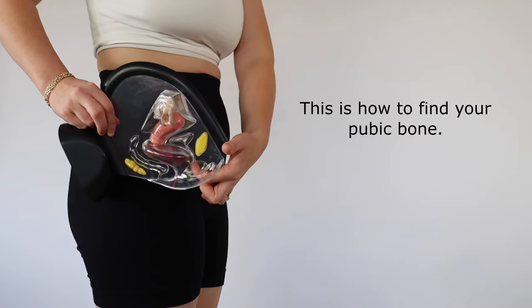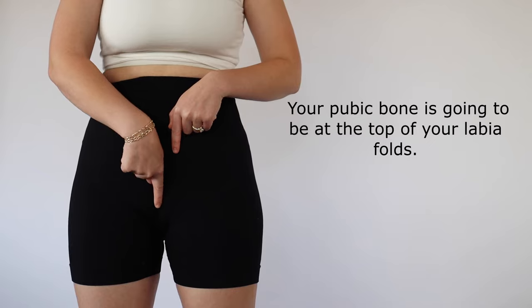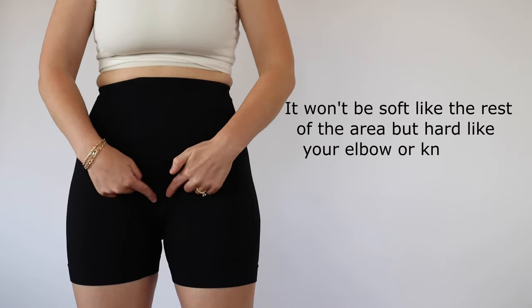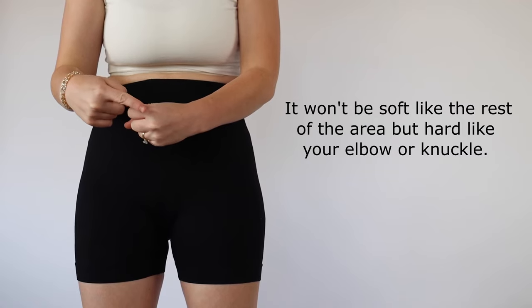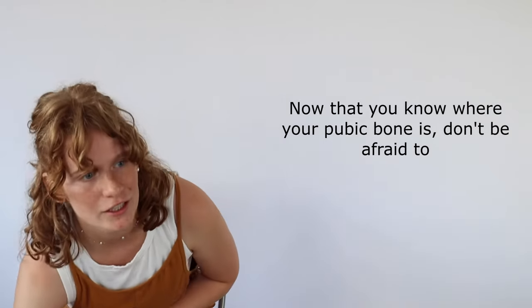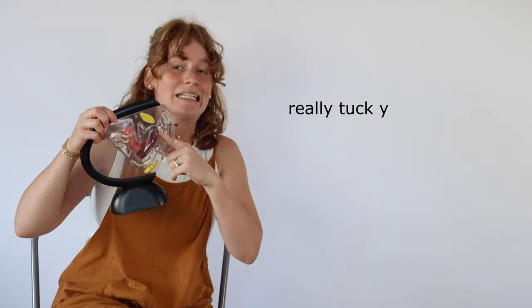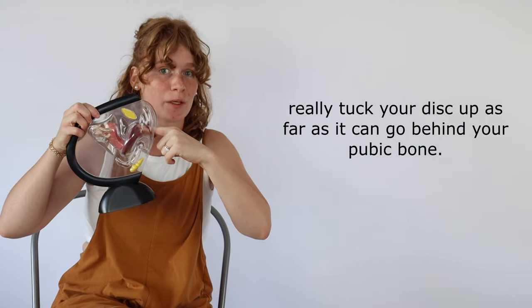This is how to find your pubic bone. Your pubic bone is going to be at the top of your labia folds and obviously it won't be squishy like the rest of the area. It's gonna be very hard like maybe an elbow or a knuckle because it is a bone. So now that you know where your pubic bone is don't be afraid to really tuck your disc up as far as it can go behind your pubic bone.